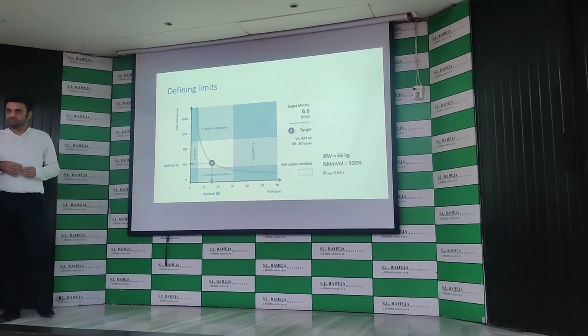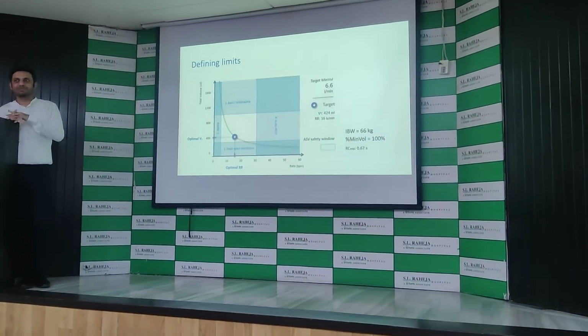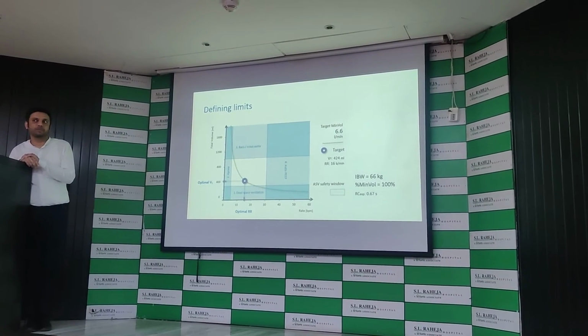Yeah, exactly. That's the entire point I'm asking. Ki, how many times does it do the test breath? Because the entire point is, does it do the test breath very often? What is the criteria to give the test breath? That is the question. Right.